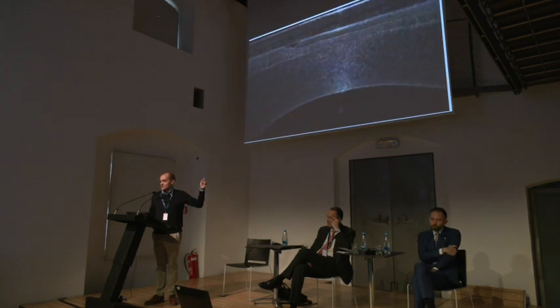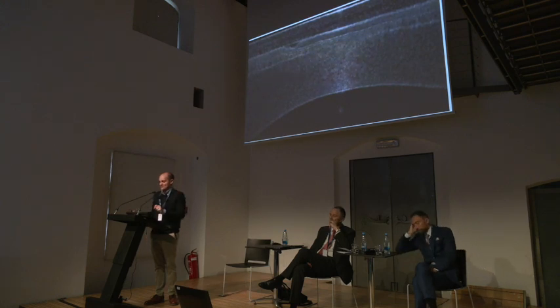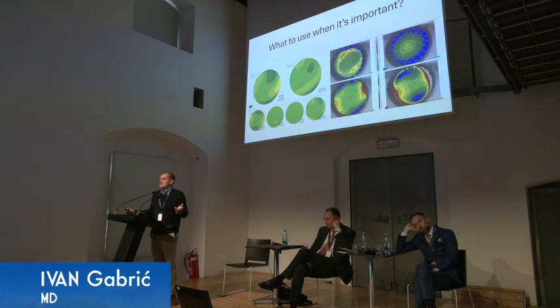And this is the image 10 minutes after the extraction, when the contact lens is on the eye. You can see the little hole where the epithelium thinned itself out to compensate for the internal little thing that was left. And that's it.